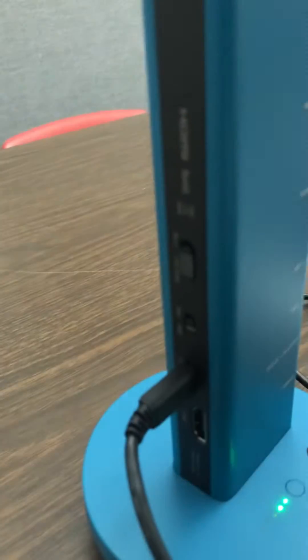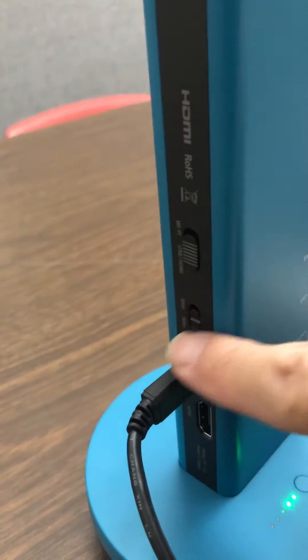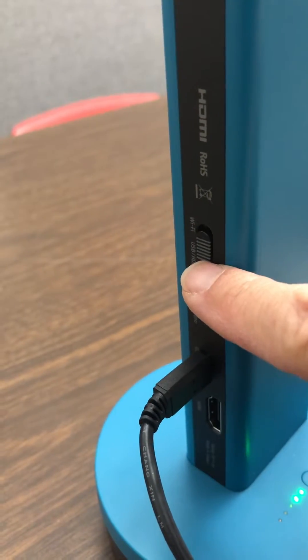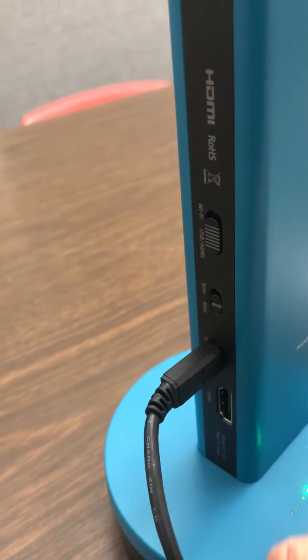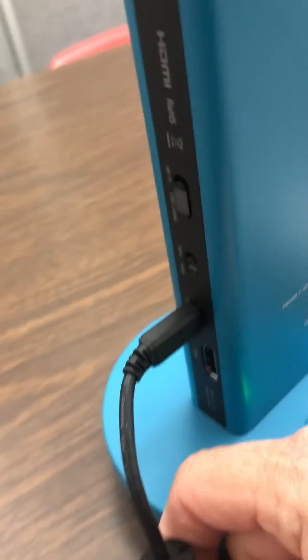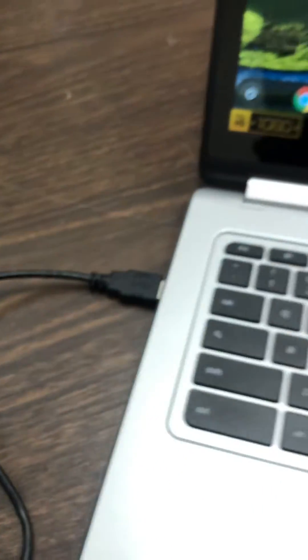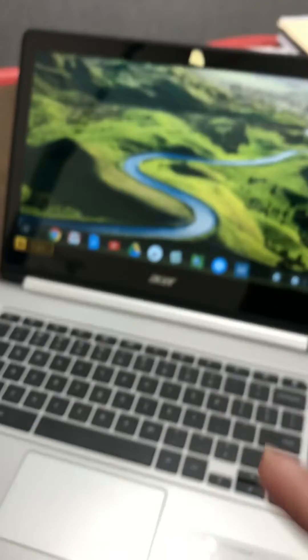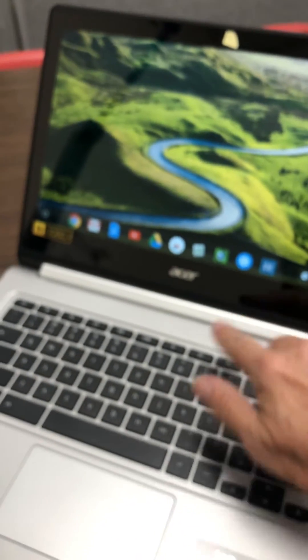So on the back there is a toggle switch for Wi-Fi or USB. Make sure it's set to USB. You're simply plugged into the camera and into the USB port of your Chromebook or computer.